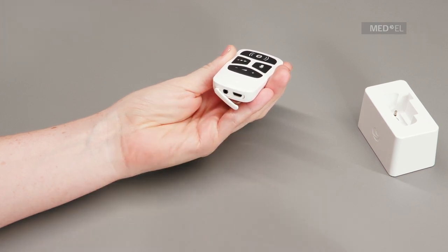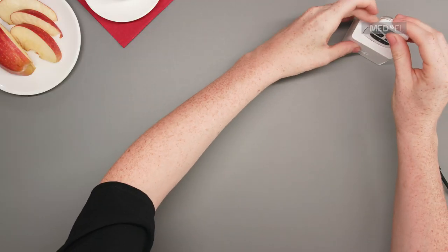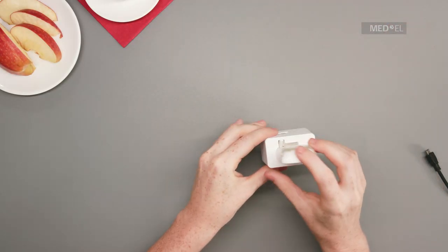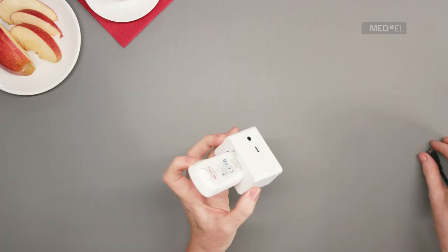Alternatively, place AudioLink in the docking station, making sure the cover sits in its recess. Then plug the microUSB cable into the docking station.